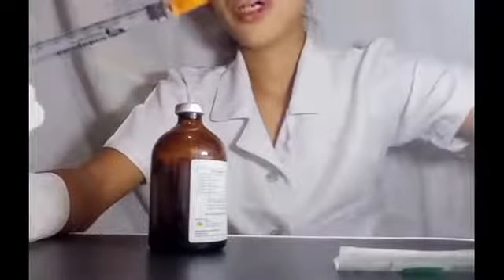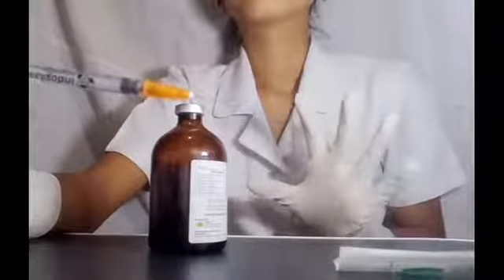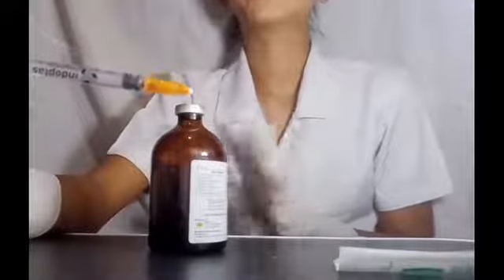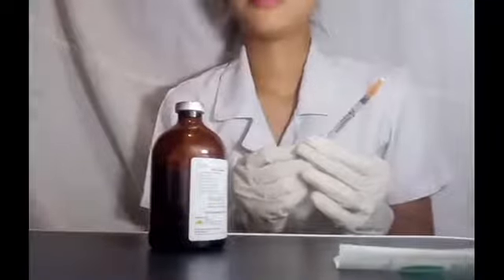For comparison purposes, this is our 5 ml syringe and a 1 ml syringe. This whole thing is equivalent to just a little bit in the syringe. So this does not hold a lot of fluid. Now we're ready to draw up.